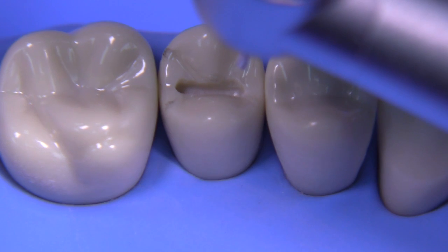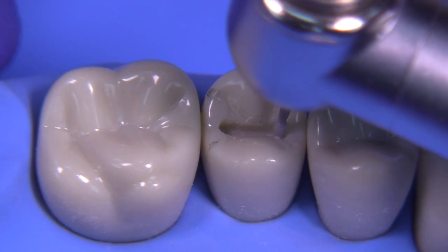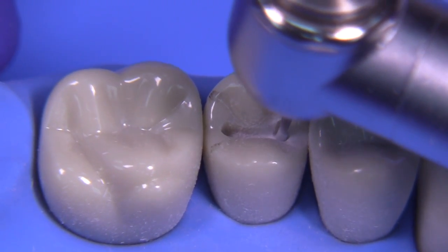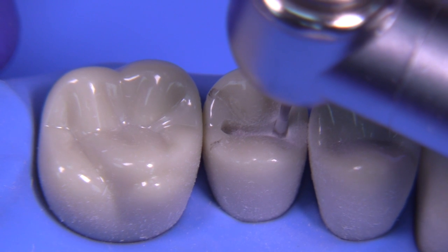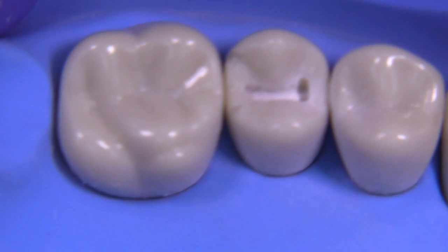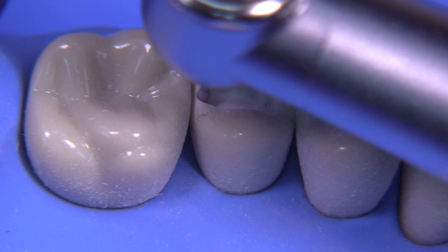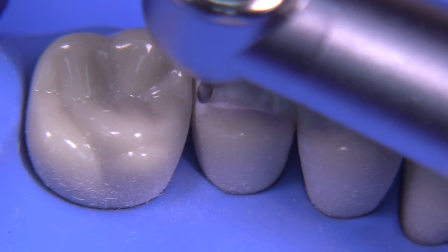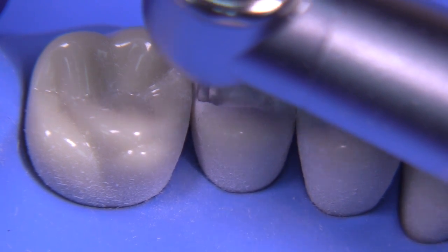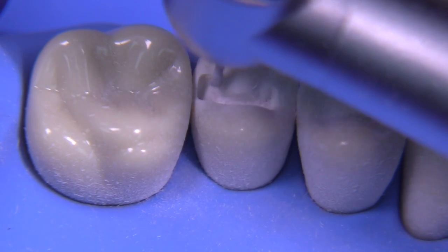Now we're ready to start the dovetail. The dovetail is just going to be an extension facially — not lingually, but just facially — and it's going to parallel the marginal ridge. Notice how I'm tipping the burr, accentuating this tip so that that wall will be slightly divergent, perhaps three degrees. Then we're going to move the burr back over towards the proximal box and widen just a little bit right near the box, merely to give yourself a little more access for the next step, which will be performed with the 245 burr.